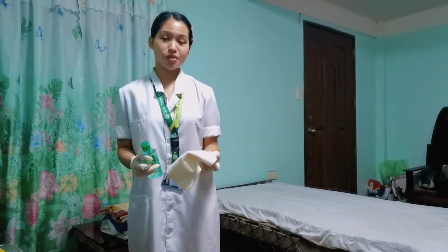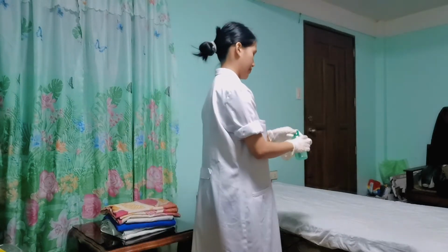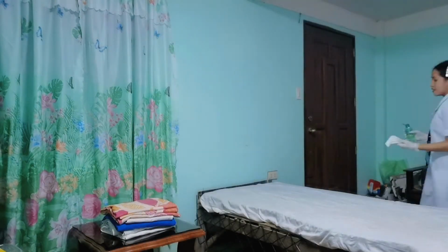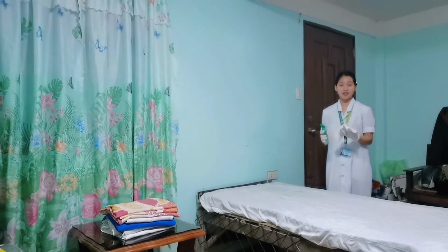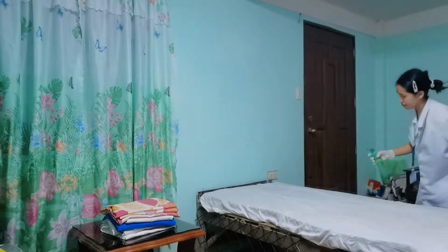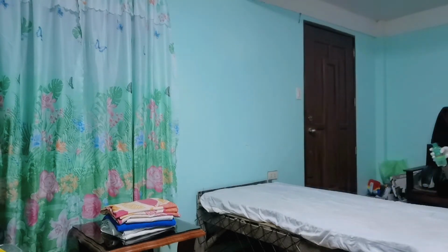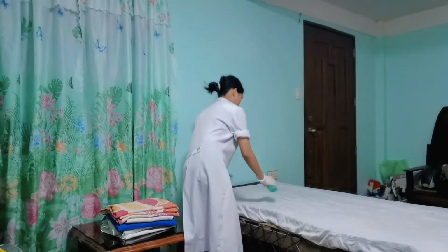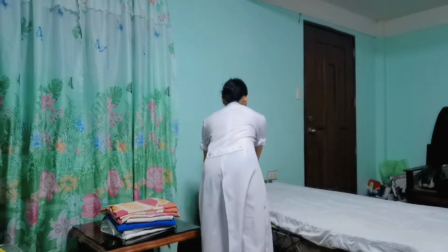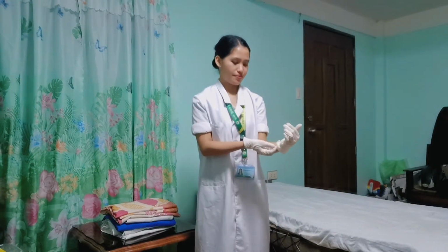And then we were going to disinfect the mattress and wipe it from the farthest to the nearest. And then remove the gloves and of course perform hand hygiene.